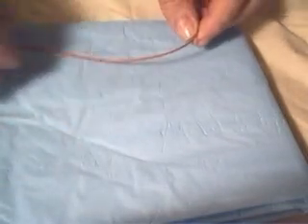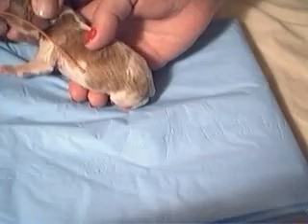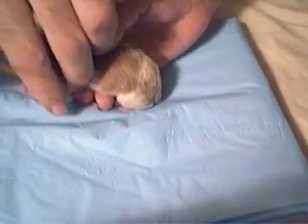Alright, next little boy is 4.5. By those rights I would say give him 4.5. I will probably just give him 4 because I'm still conservative. I would measure him, and he's going to go to about that length.